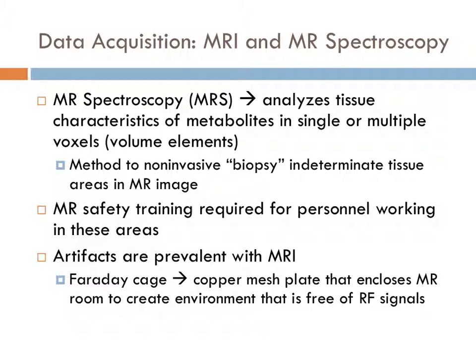These are major issues, and safety training helps prevent these errors for the personnel working in MRI. Effects of strong magnetic fields, fringe fields, radiofrequency excitation, heating, and dangers of ferromagnetic materials must be known for the safety of the staff and also for the patients.